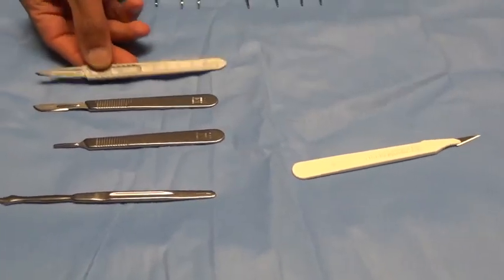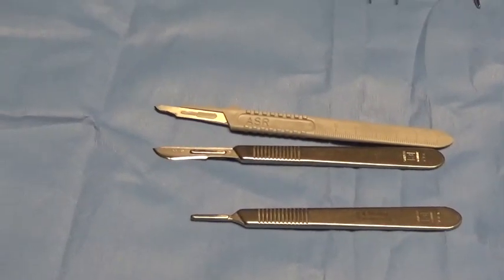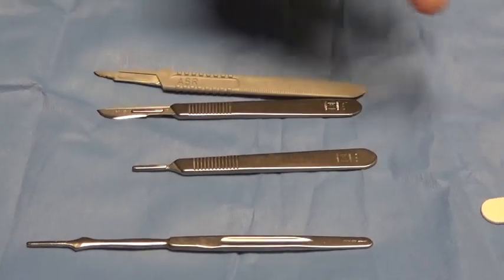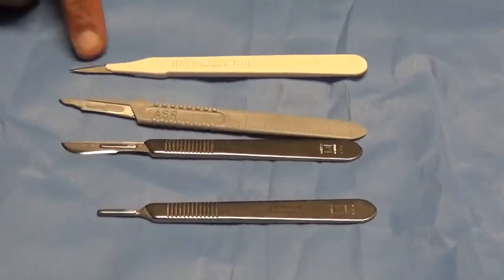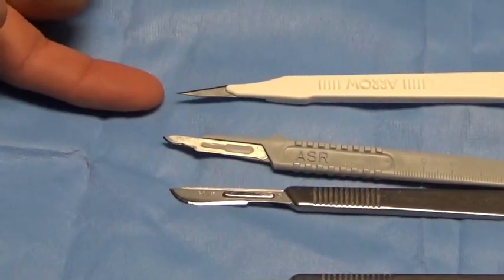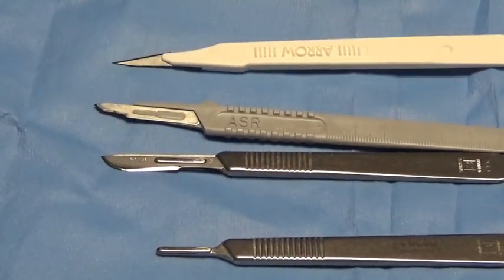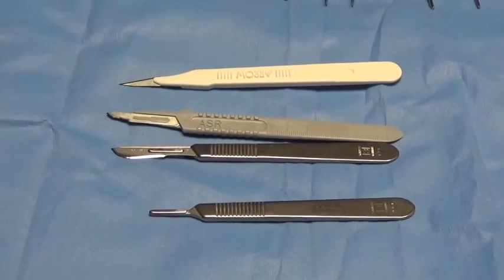The next instrument is a number 15 blade — this is a disposable 15 blade — which can be mounted on a number three or number seven handle. Number 15 blades are used for smaller incisions: hernias, breast biopsies, skin lesion incisions — generally meant for smaller, more precise incisions. The last type of blade is a number 11 blade. Unlike the 10 and 15 blades which have beveled cutting edges, the number 11 blade has a straight cutting edge and is essentially used for stabbing motions — not for planned skin incisions, but rather for stabbing incisions such as central line insertions or abscess drainage.